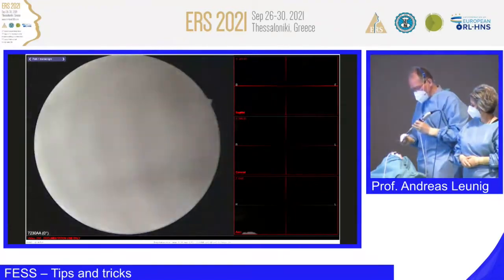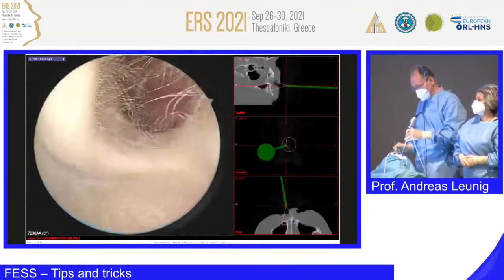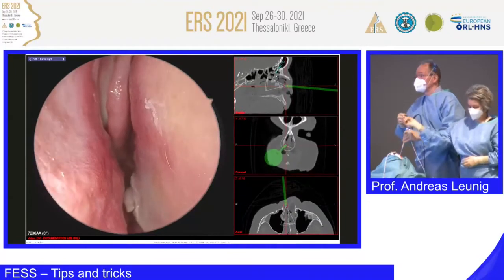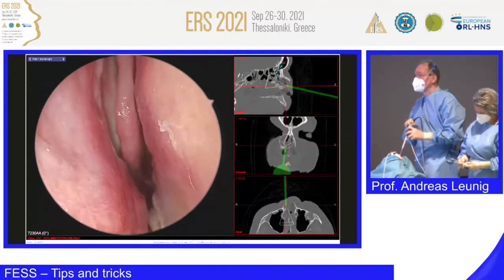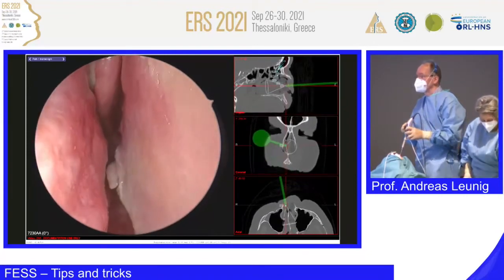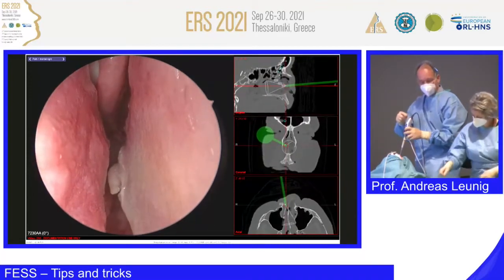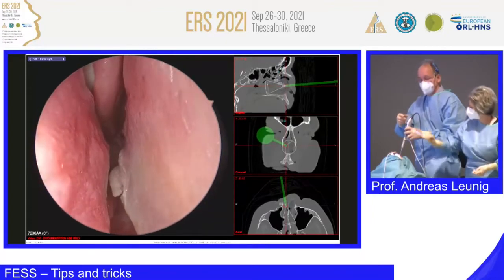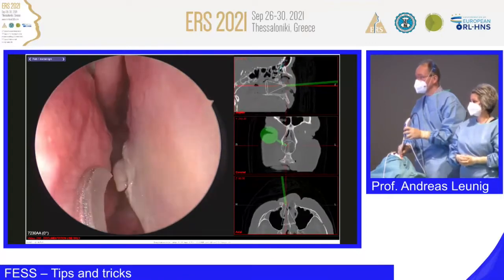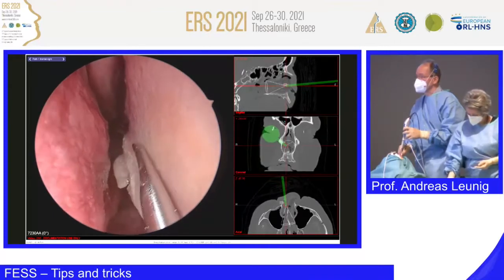So I stay on this side. We will see how much we can do surgically. And now, before we do the first step of functional endoscopic surgery, we go maybe a little bit more here to the septal spur and crest. Please, Josef. Or the sickle knife first. I take a sickle knife, and I can tell you, this is for me really something which is fantastic, to use the endoscopic technique for dealing with septal pathology.